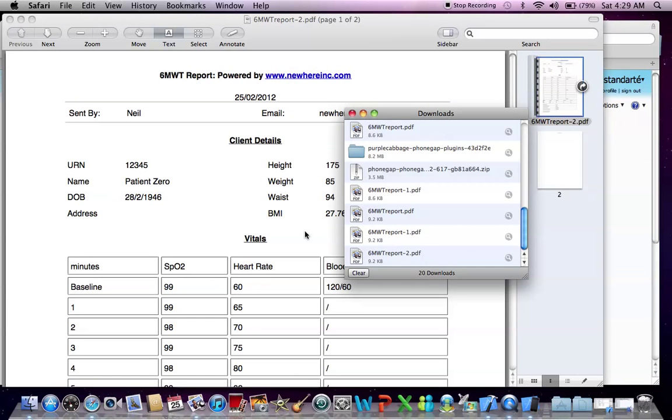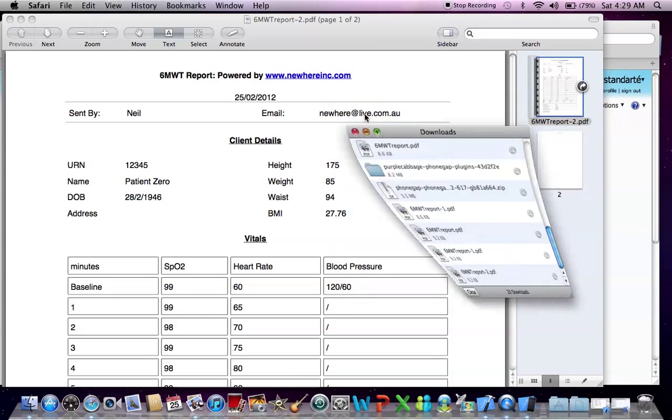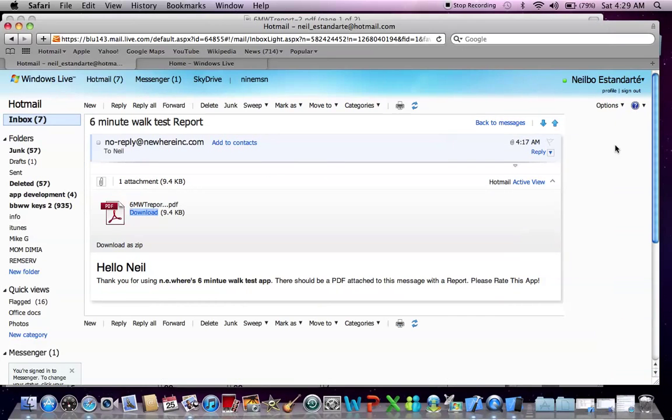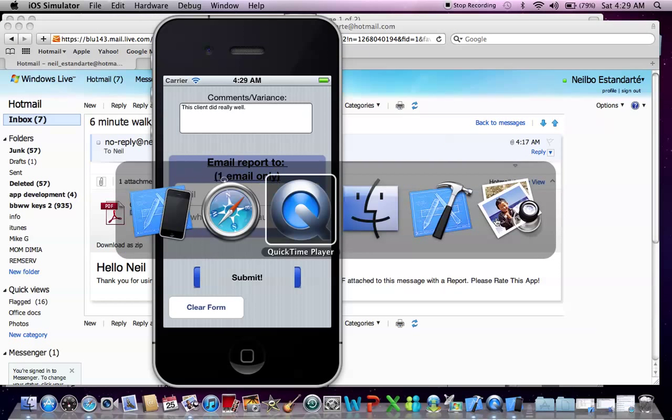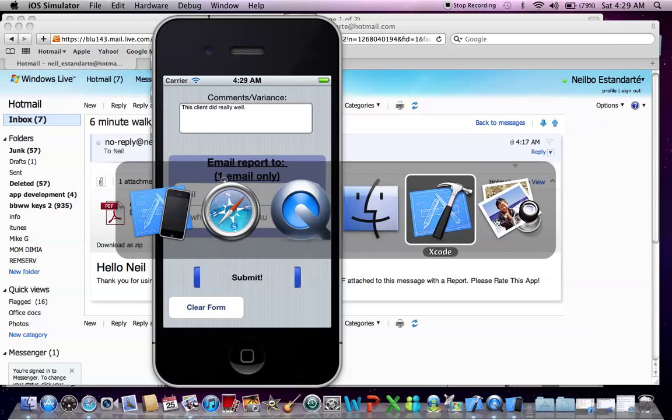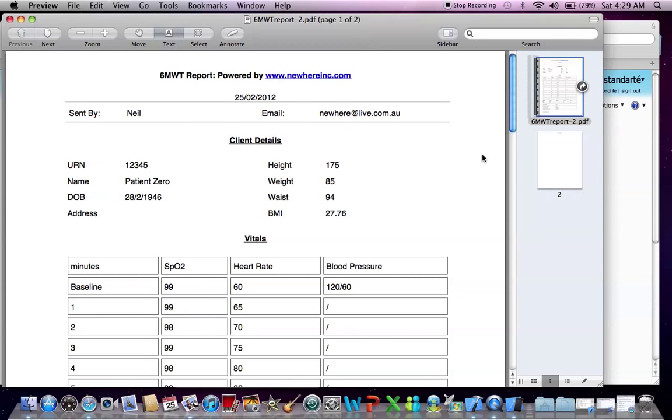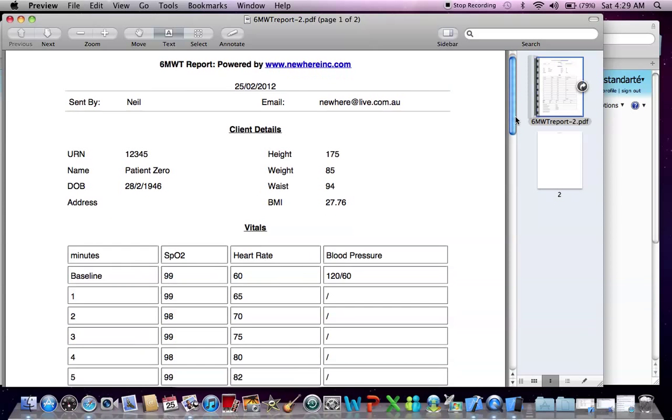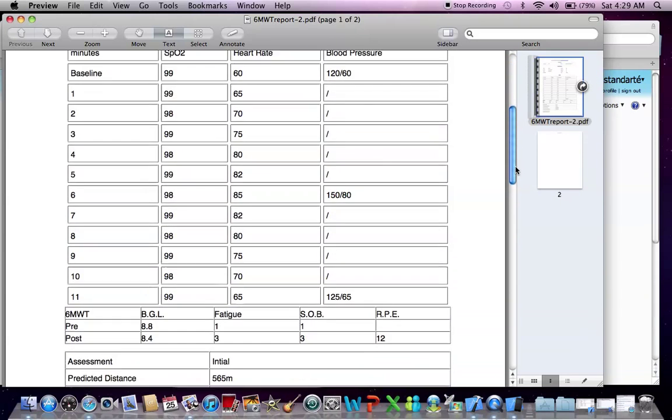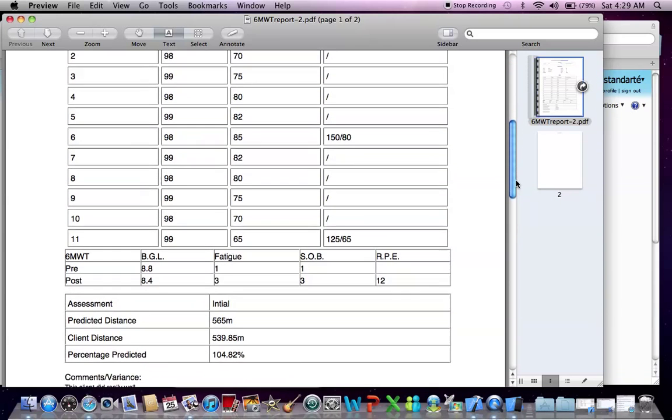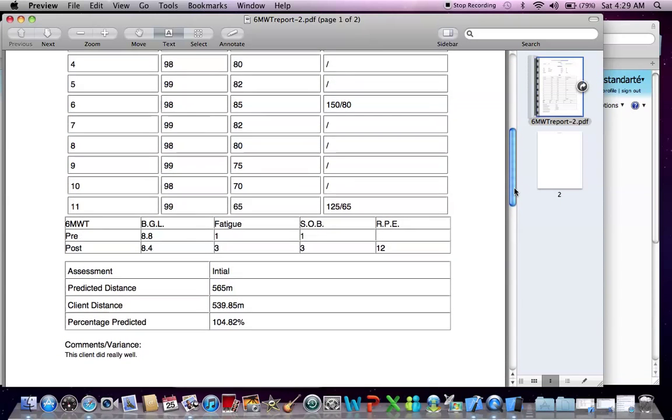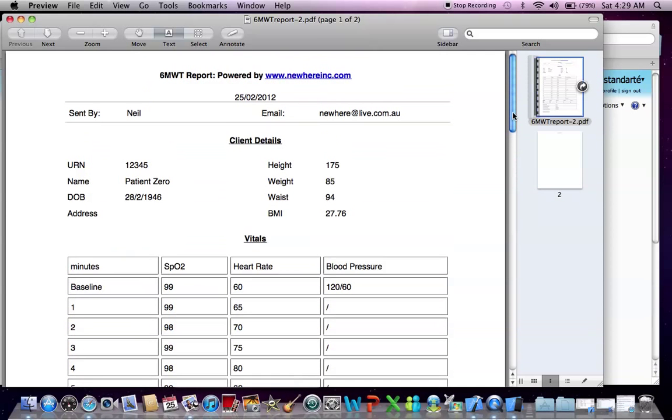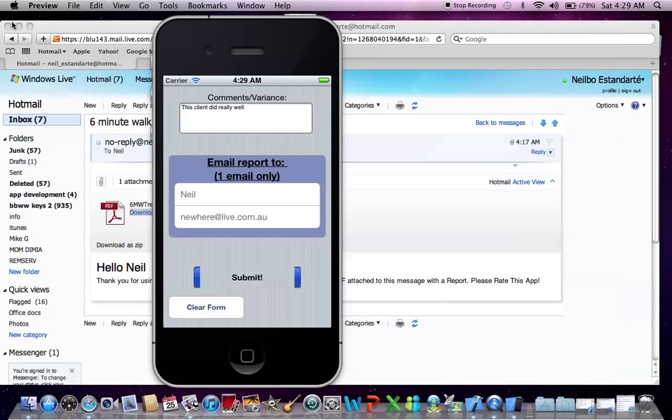So there we have it. Everything that I did put in has been put in there. And there you have it. The report's all been sent to you. Now you can print this out and give a copy to the client, any other health professionals involved in his care.